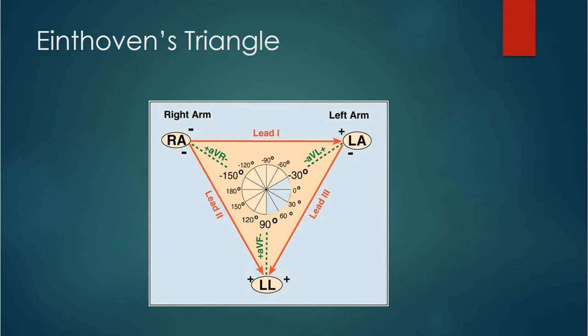The third thing I want to cover is Einthoven's triangle. Dr. Einthoven was the Dutch physician who invented the first practical ECG that could be used to really see heart rhythms and things like that. There's a lot of information in front of you to be such a simple picture. Pay particular attention to lead 2. This is where you'll do a lot of your diagnosing as far as rhythms, or arrhythmias to be more specific. Also look in the middle, you'll see your pie chart there.